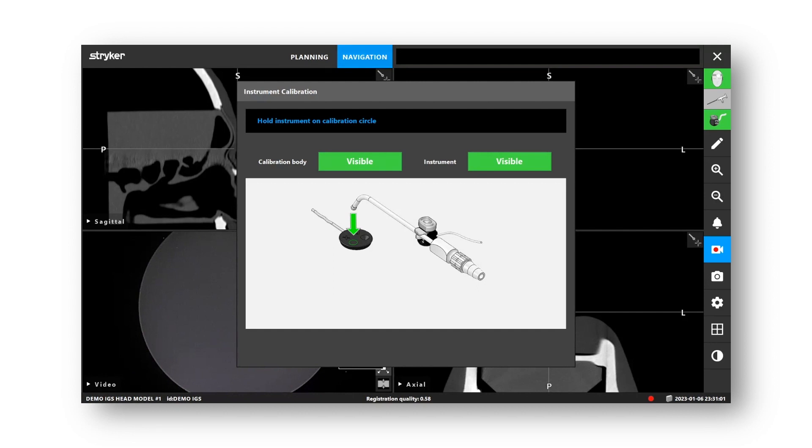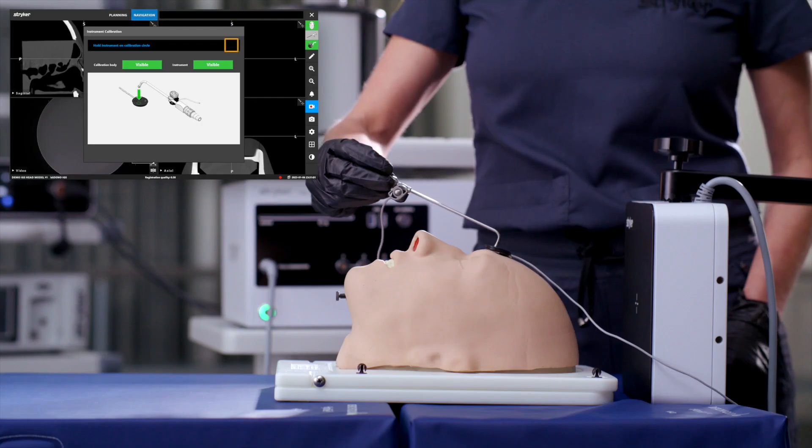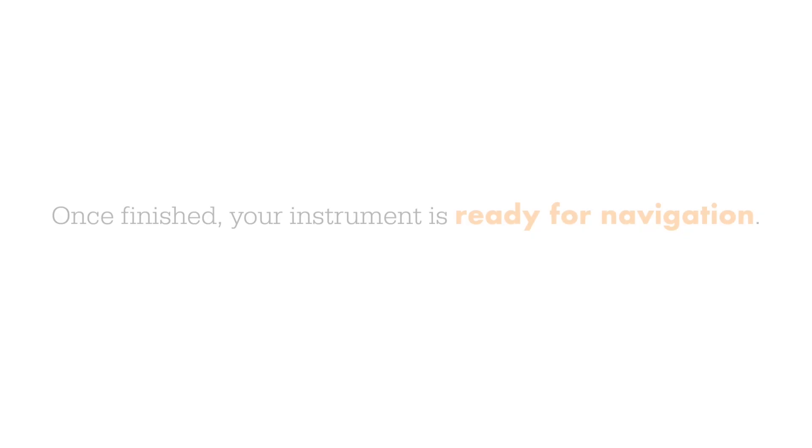Then, place the tip of the instrument on the flat circular plane next to the cone and wait for the software to complete this step using the same indicators. Once finished, your instrument is ready for navigation.